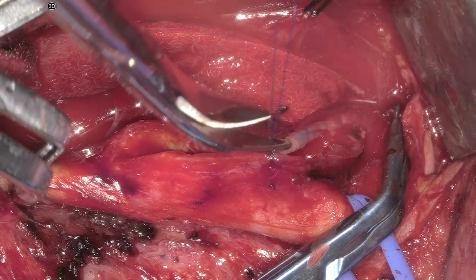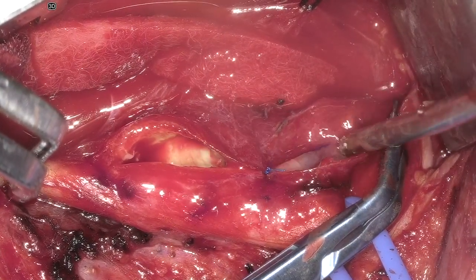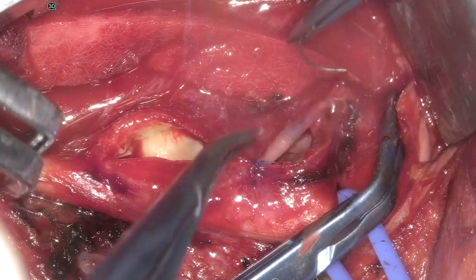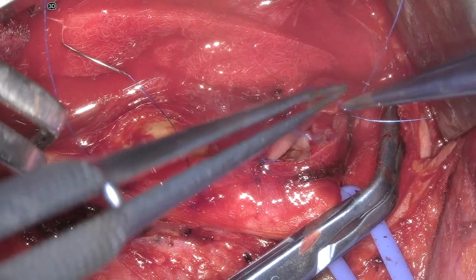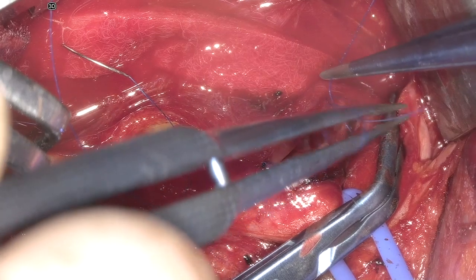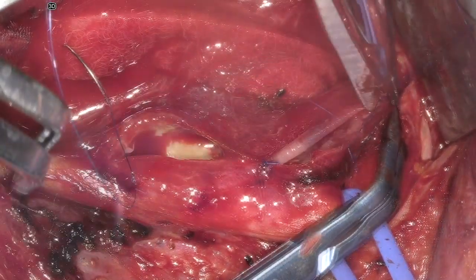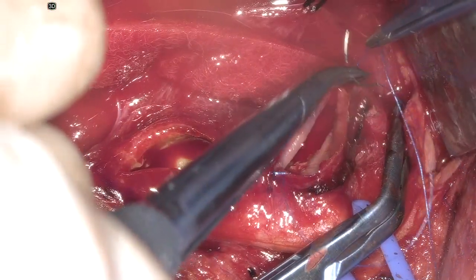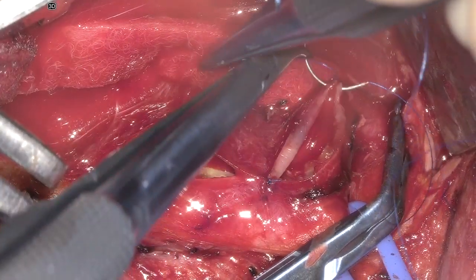We start the continuous stitch with a running locked stitch beginning distally at the internal arteriotomy site, then running in a locked fashion toward the common. This is all done under the operating exoscope — the entire closure as well as the endarterectomy. We run this stitch carefully gathering just enough of the two sides of the artery, especially at the level of the internal, running proximally.